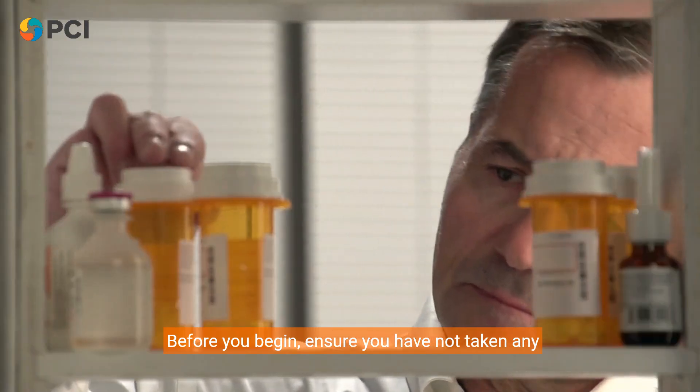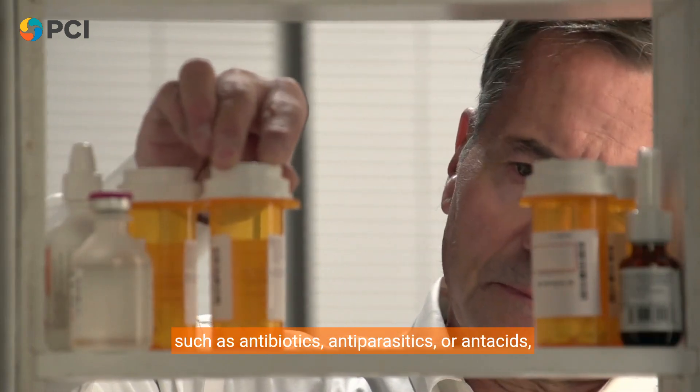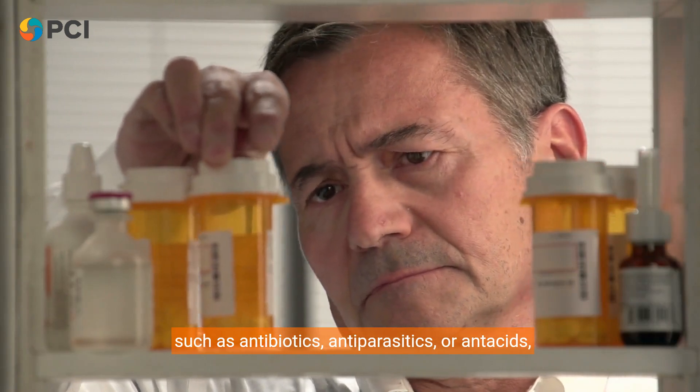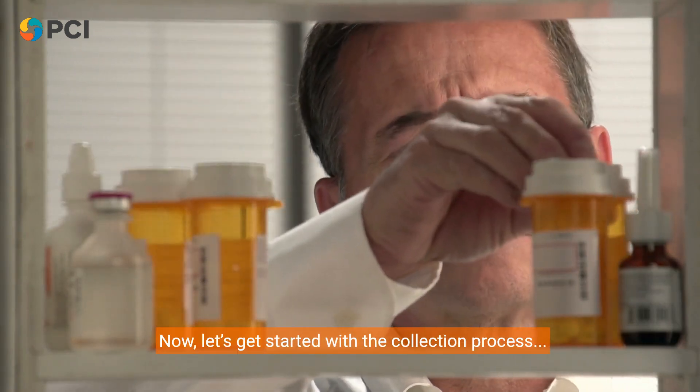Before you begin, ensure you have not taken any medications that could affect the test's accuracy, such as antibiotics, antiparasitics, or antacids, for at least two weeks. Now let's get started with the collection process.